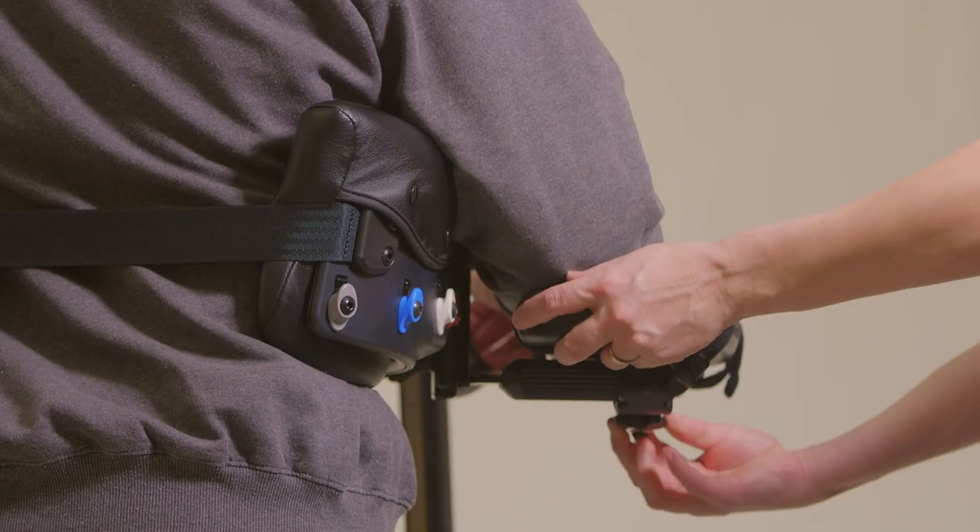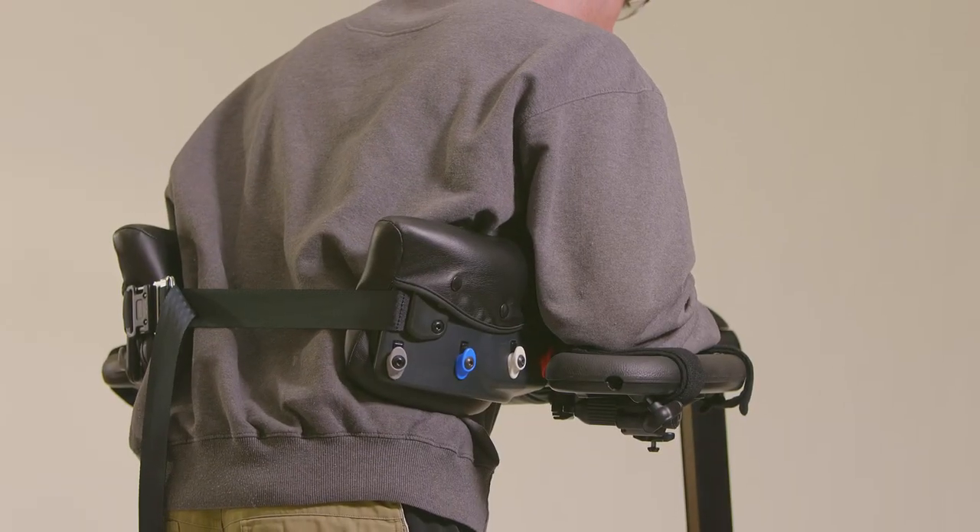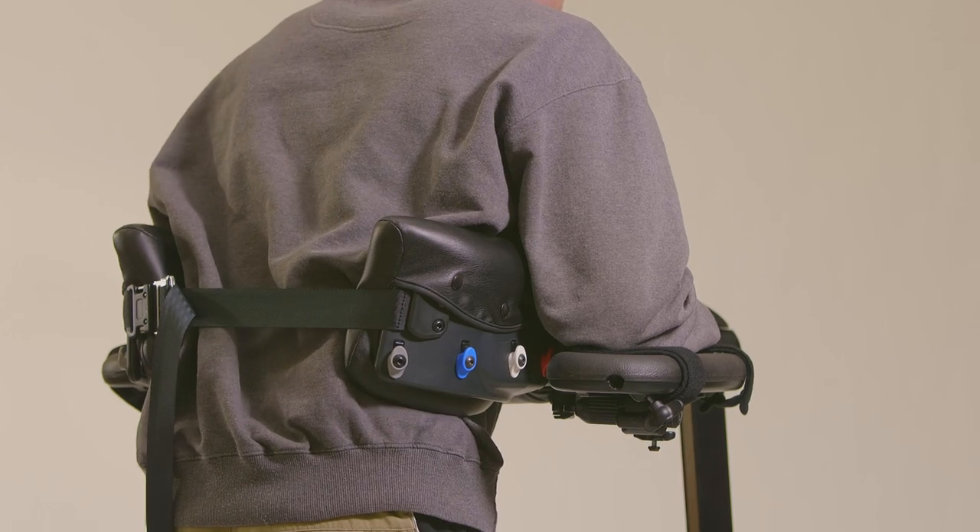Position the armrests close to the patient's sides and directly under his shoulders so he can optimally depress his scapulae and press down through his elbows.